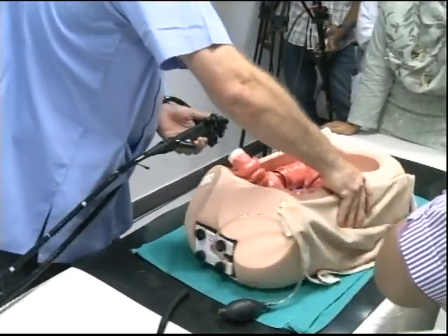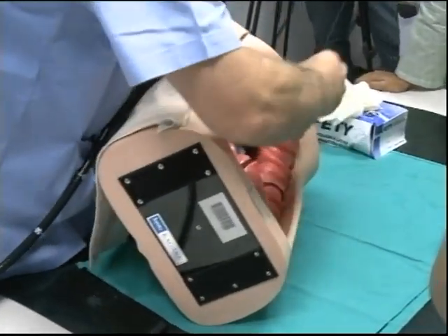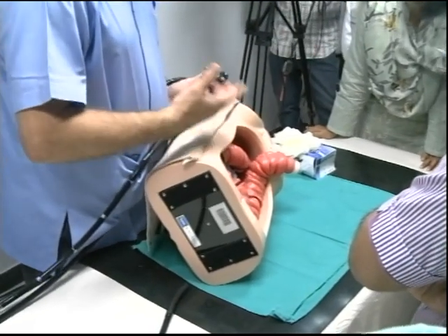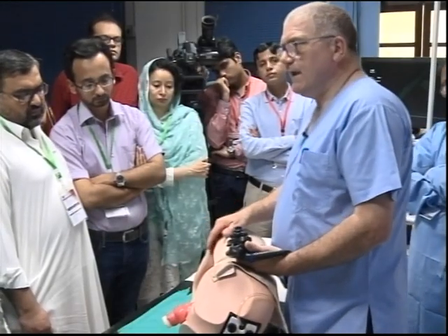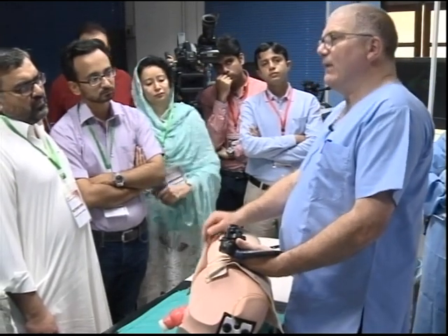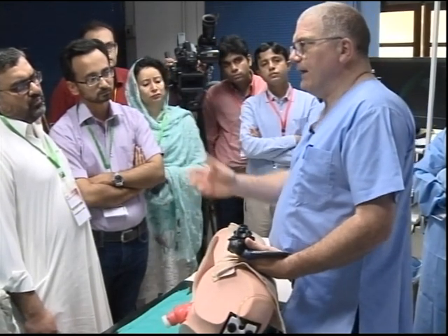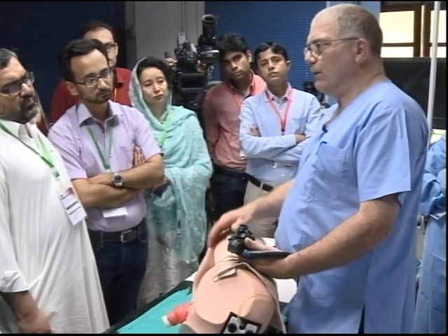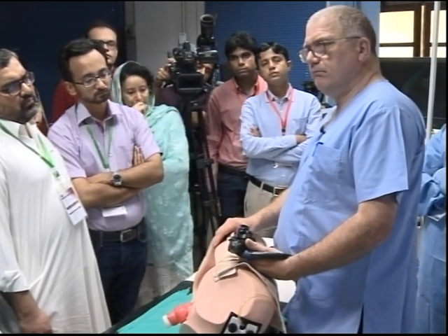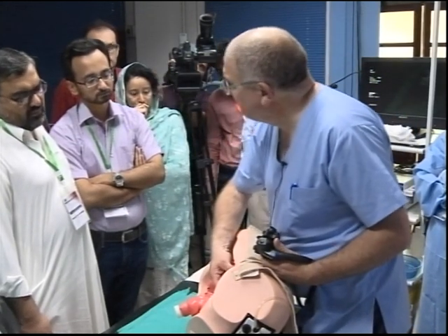Okay, let's put the patient in the right lateral. Let's see what happens. The cecum starts to deflate, and look here. Naturally. So if I was to say to you, what's the best position to have the patient in if you can't insufflate the left colon, if you're having difficulty and the patient's got pain, to negotiate the sigmoid? It would be the right lateral. Look at this now and look at this in comparison.